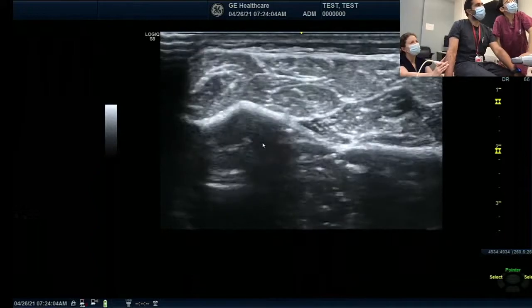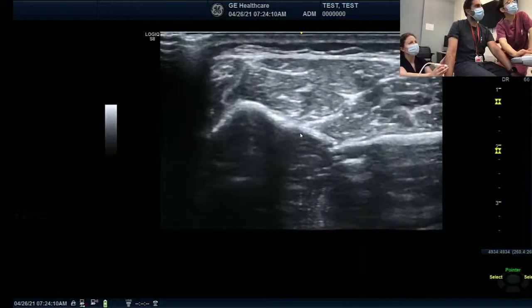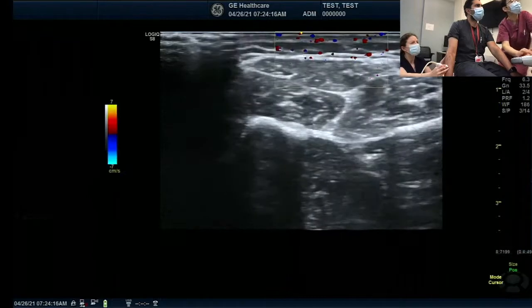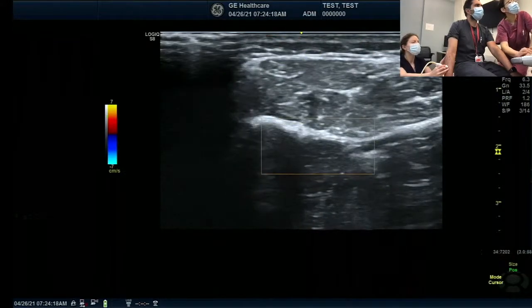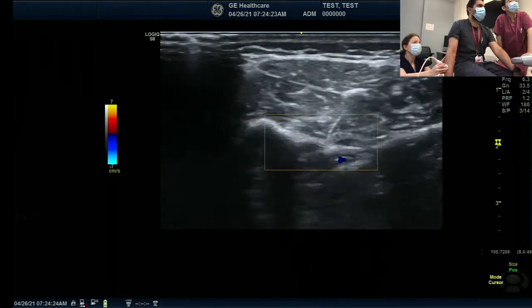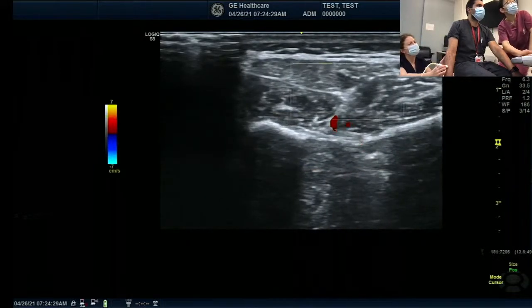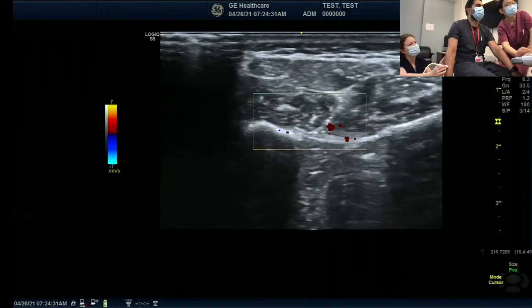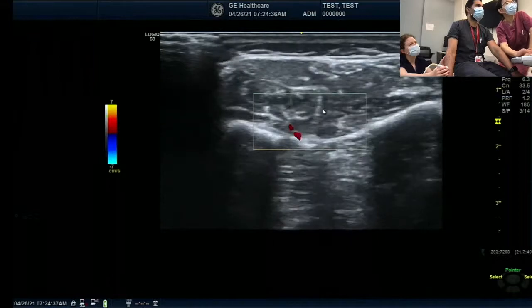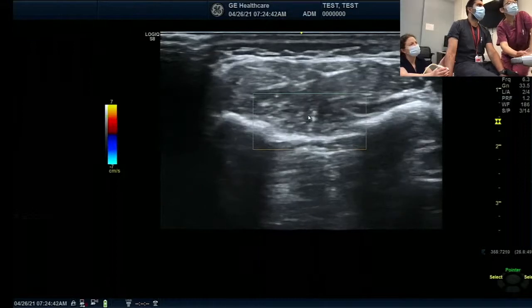Follow this nerve. Are you moving distally now? Yeah. Maybe you want to stay over there. Let me use color flow. Just wait a little bit. Can you toggle a little bit? Oh, it's very small. Oh, there. Looks like that area, right? This in the middle with our cursor. This area is coming. Oh, now I see it here. Wow, it's beautiful.